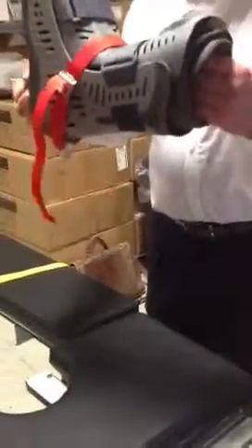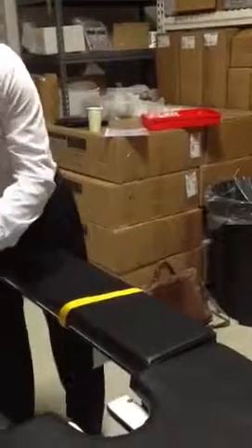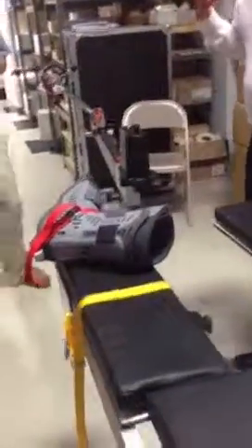You'll end up using this one 85% of the time, in our experience. So the kit comes with two options. So this is called medium and that's called extra small. There's no point relabeling them, but they're the smaller one and the bigger one in our case.